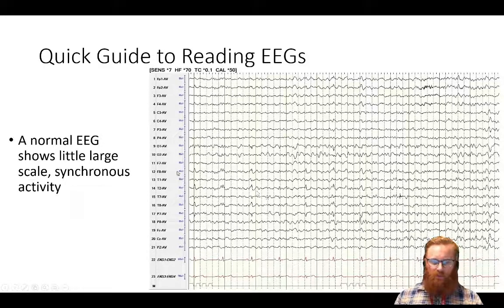And this is a roughly typical EEG signal. So there's not too much synchronous large scale activity. There is some. You can pick it out, for instance, here over these frontal electrodes, you can see that something happens simultaneously here. There's a funny little high frequency burst of activity here. It kind of looks to me a bit like a cell phone, to be honest with you. But this is not a super abnormal recording.